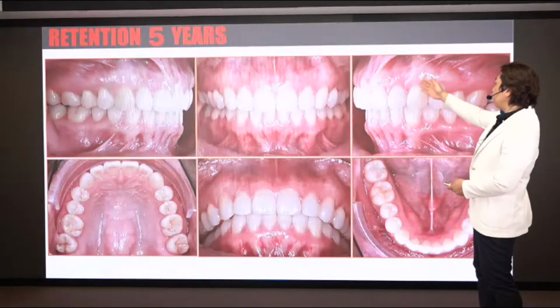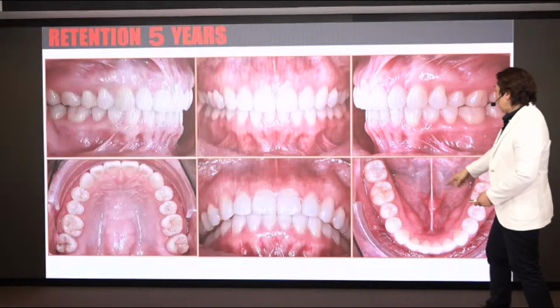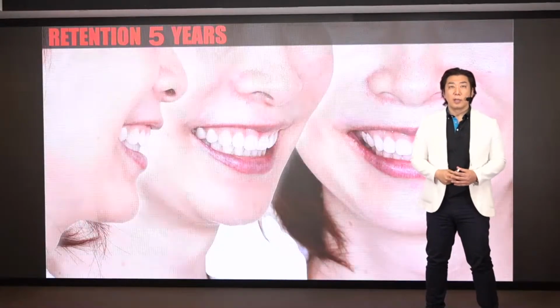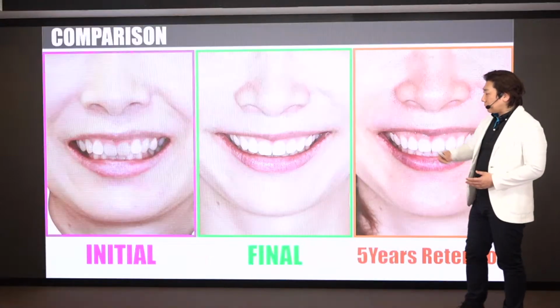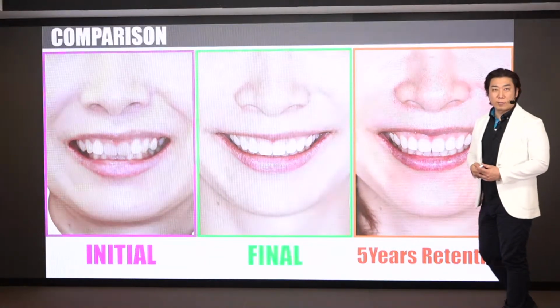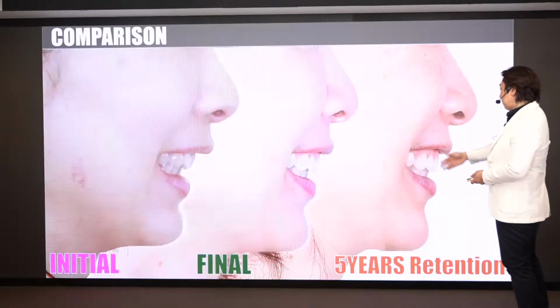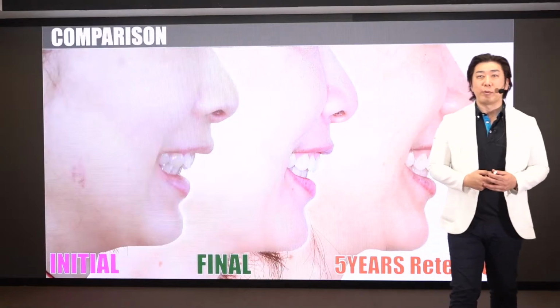Have a look. Midline is correct. Canine position is achieved. And the upper and lower are stable. This is 5 years retention. After 5 years retention, smiling is still beautiful. Initial, final, 5 years retention. Today I already shared my experience. This is the initial, final, 5 years retention. This is the class 2, division 2, non-extraction approach.